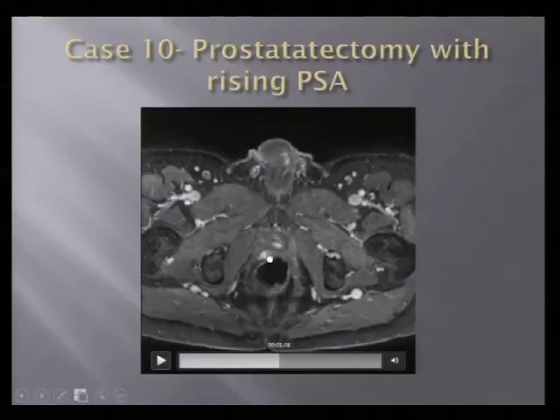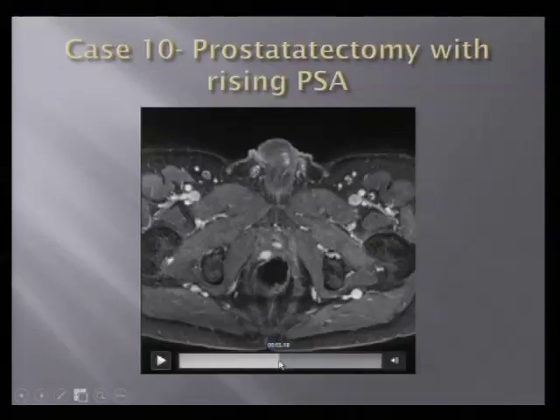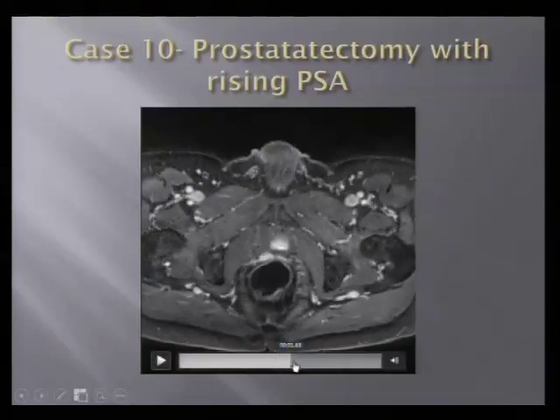I will say, it is difficult to know is this prostate cancer or residual prostate tissue that is left after the prostatectomy. I've actually never been in the OR to see a prostatectomy, to know how likely is it that there's going to be prostate tissue left there or not. However, with a rising PSA, my presumption is that that's going to be residual cancer. But this is another case where we did not have the histology.